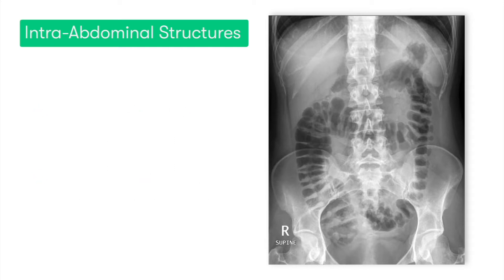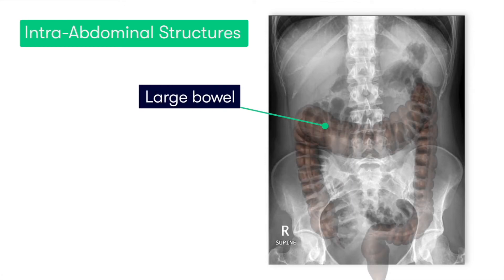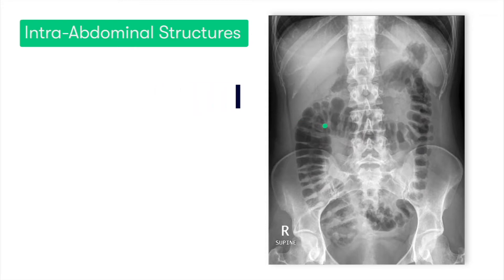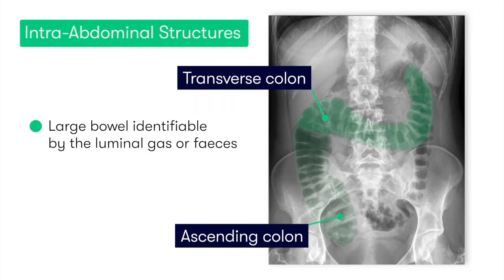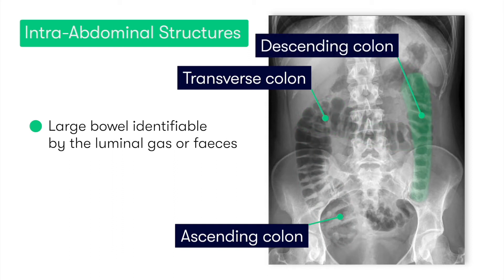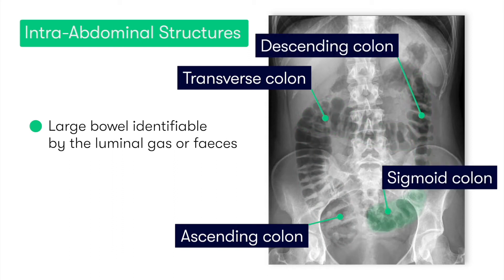Continuing on distally along the GI tract, we get to the large bowel, which you can see here, lying in the peripheral aspect of the abdominal x-ray. More often than not, we should be able to identify the large bowel because of the presence of luminal gas or feces.